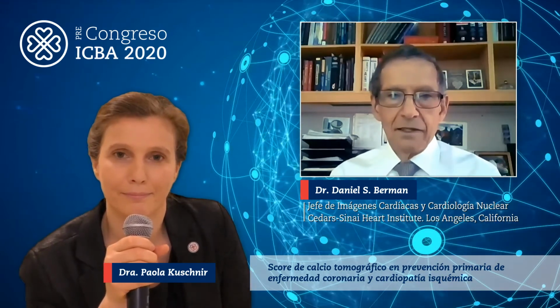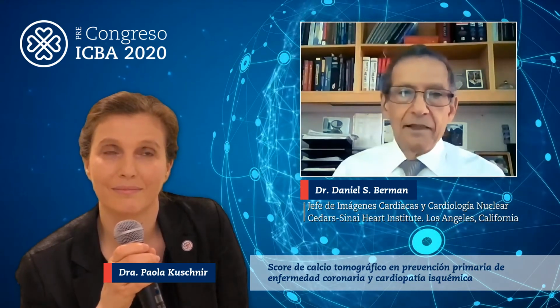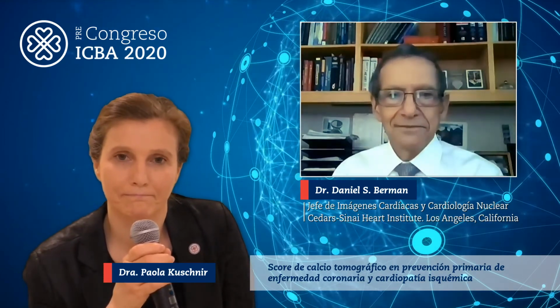Right. So this allows for a personalized approach to treatment. Risk factors work in populations. So a high cholesterol in 1,000 people means a higher risk of events, or hypertension or diabetes. All the risk factors are only factors. They don't represent all of the factors that cause atherosclerosis, and they don't tell us how those factors are acting in an individual patient. And that's what the calcium scoring does. It overcomes all of the limitations of global risk factors when they're applied to an individual patient.